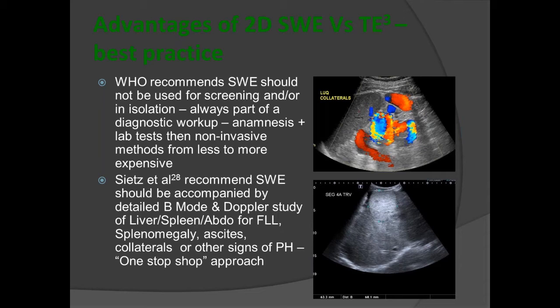Other manufacturers then came up with 2D shear wave, and this is what we use here at Fiona Stanley. So we have two vendors, and we basically introduced this technique to match the Fibroscan. So again, why would you use 2D shear wave when you have a Fibroscan service? Well, it starts with looking at the World Health Organization recommendation, and they said that shear wave elastography should not be used in isolation. It should always be a part of a good diagnostic workup.